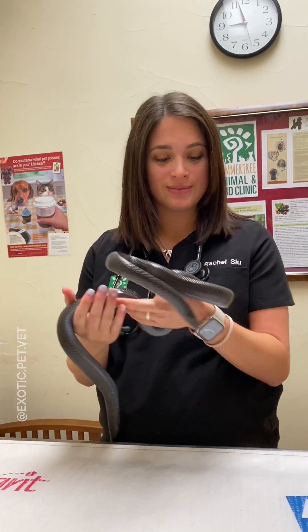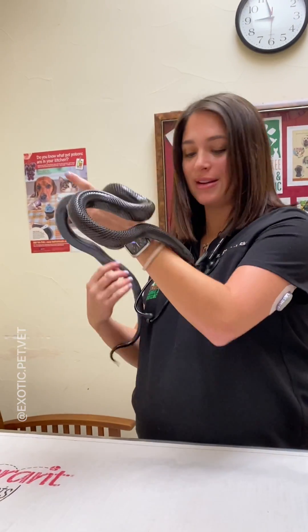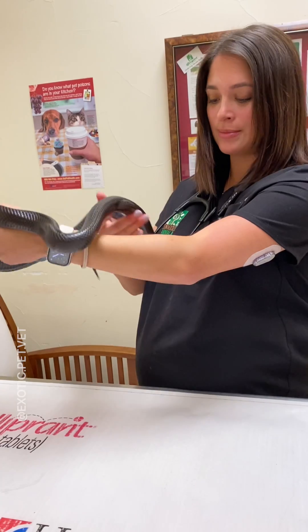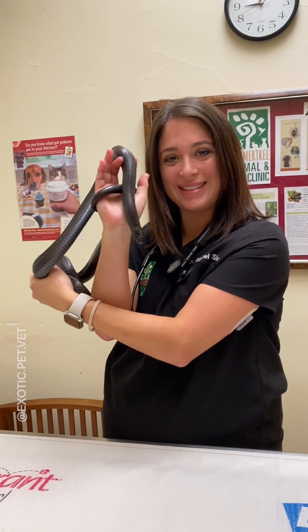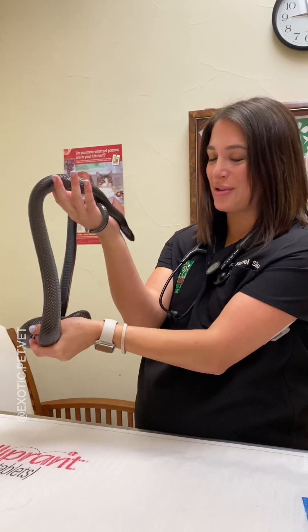Have you ever wondered how veterinarians give snakes fluids when they don't have arms or legs? In many instances we give them subcutaneously, or underneath the skin. My name is Dr. Sue, and here I'll be demonstrating how to give fluids to this beautiful kingsnake.